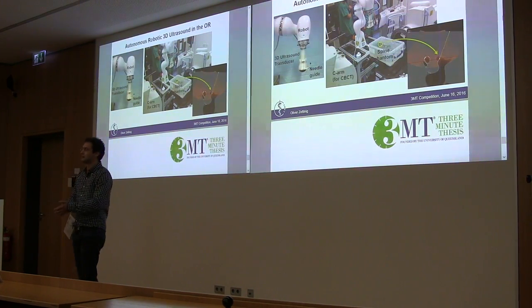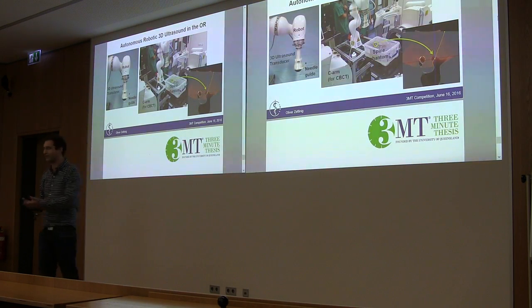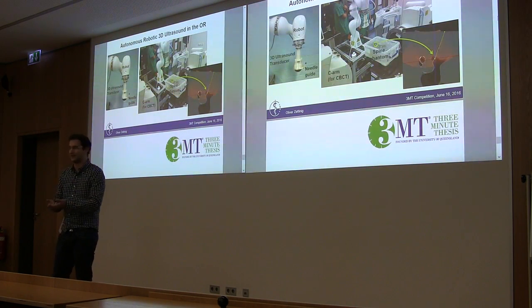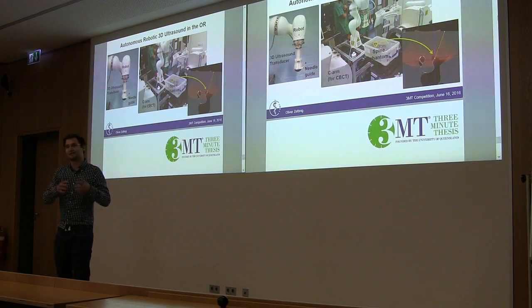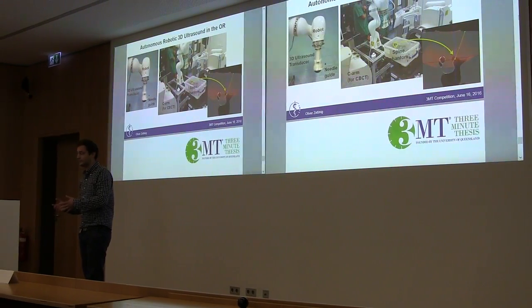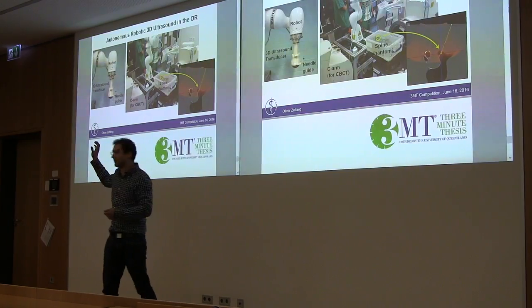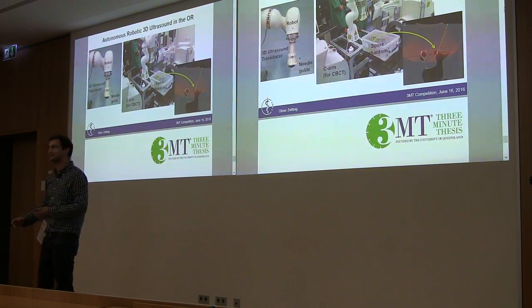He was joking, of course, but reading between the lines, you realize he somehow accepted a lifelong X-ray exposure. And that's kind of sad, because I think there's a lot of procedures we can do without X-ray. And that's my topic: why we need ultrasound and robots for that.